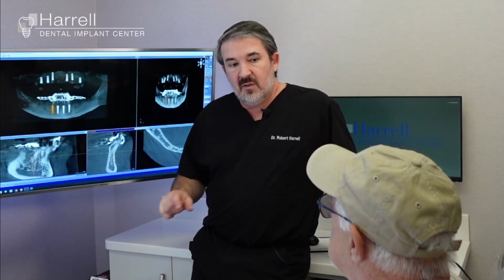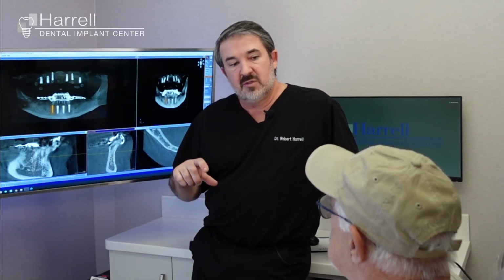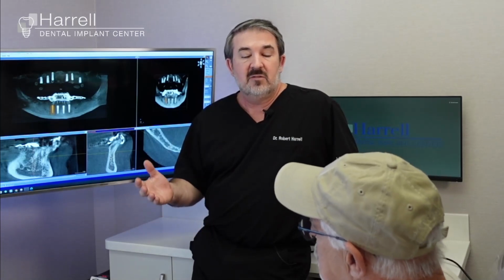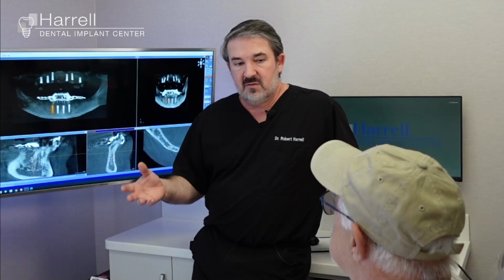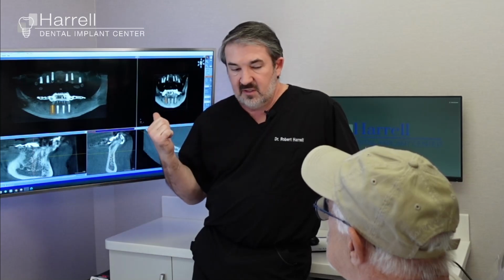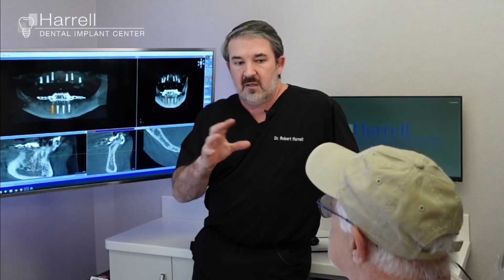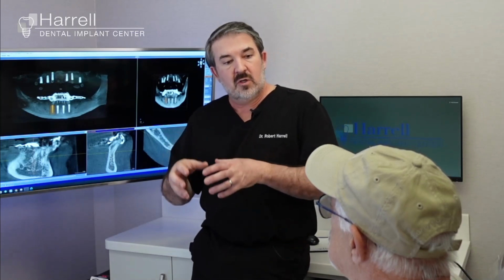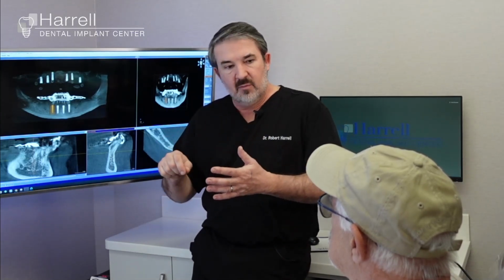Then at the 3-month interval, you'll come back and we'll start the process of converting you over to your final set. That's usually a series of about 3 or 4 appointments. We go through some of the similar records from the initial phase, where we would take the face scan and the intraoral scan, another CT scan. All that data goes back into the software so that we can see where you currently are. We locate all the implants within the software. That's where we make all the adjustments.